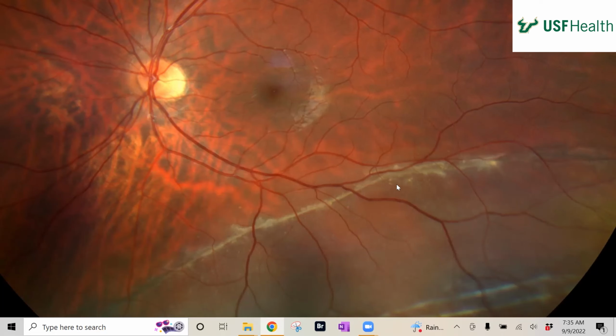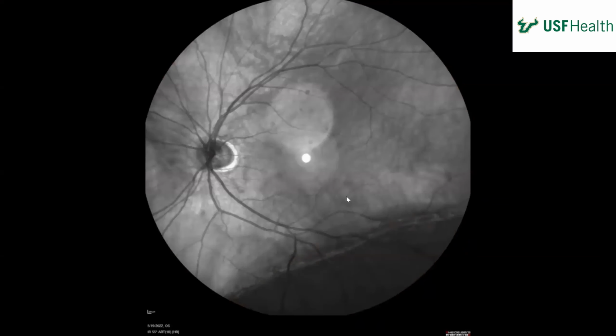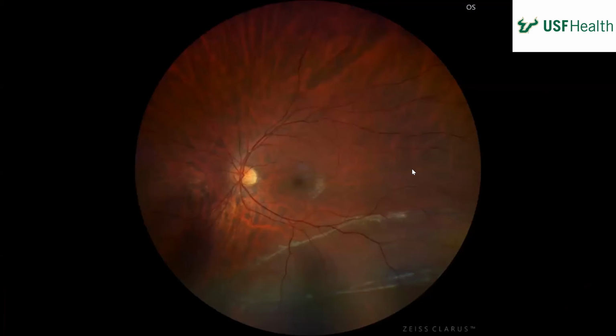So these spots here I was referring to. Then really distally, there's a couple more linear furrows behind here. Keep going. Okay, this looks like the same eye, just more zoomed out. We're seeing again more of this distal linear furrows, I'll call them. Maybe a white spot here. Otherwise, that's the periphery. I don't see anything new to comment on.